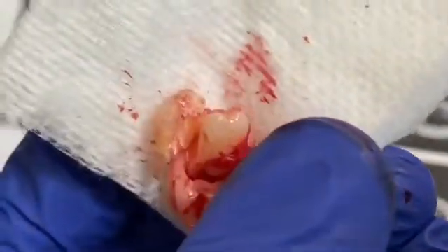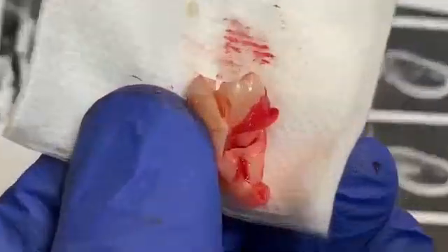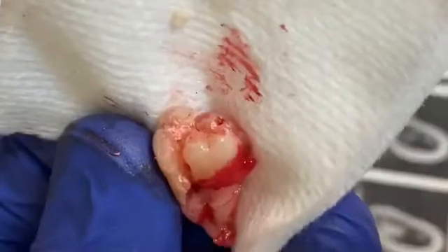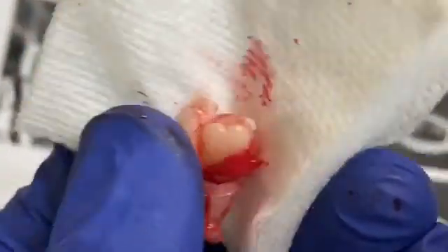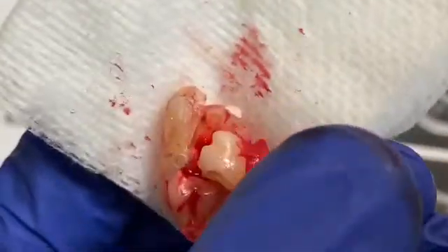It took me about 10 to 15 minutes, but it wasn't that bad. The patient was a 22-year-old Asian American, so the bone wasn't that hard. You just need some kind of leverage to luxate the tooth and it should come right out after you flap the case.